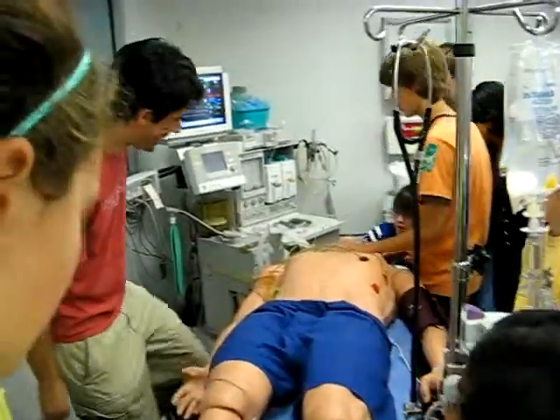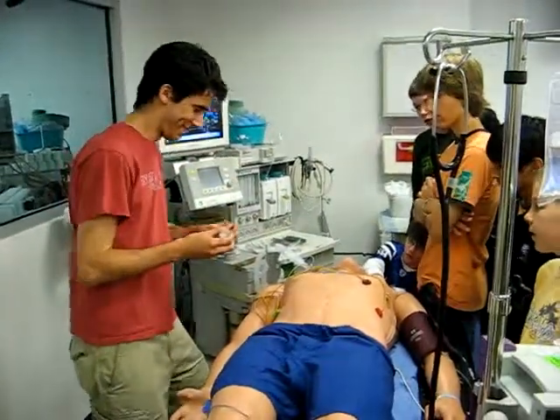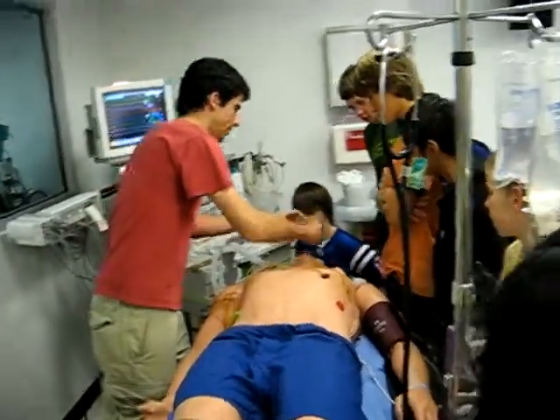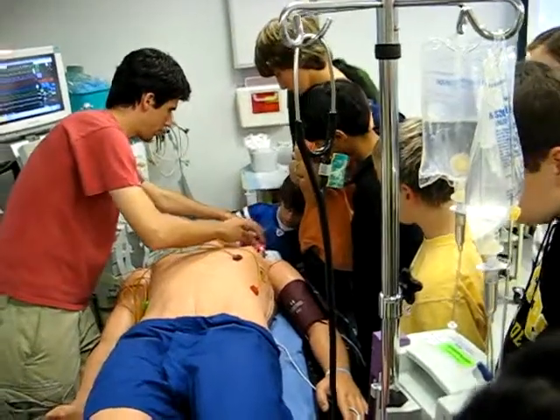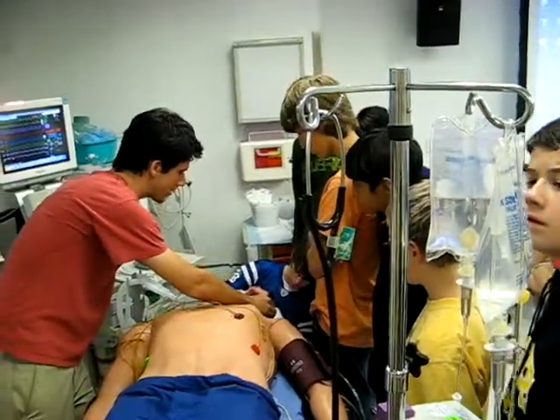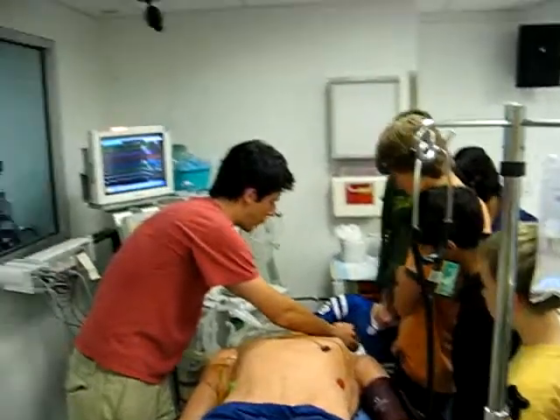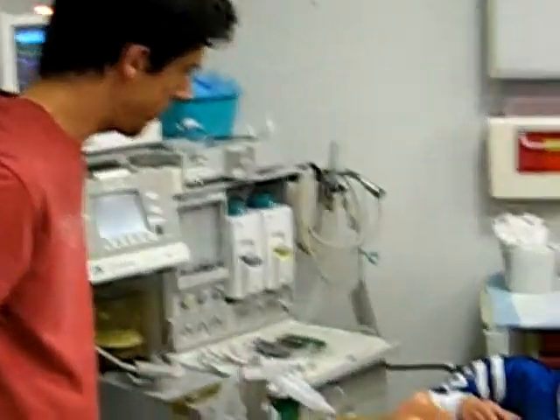So, one of the best features about Stan is that we can administer drugs to Stan. So, yeah, that's your jaw right here. So what we're going to do is just screw that on right there. Push it, just push in a little more. There you go. No, this is just distilled water, but the computer is reading a barcode. So now push in as much as you want. There you go. Okay, good.